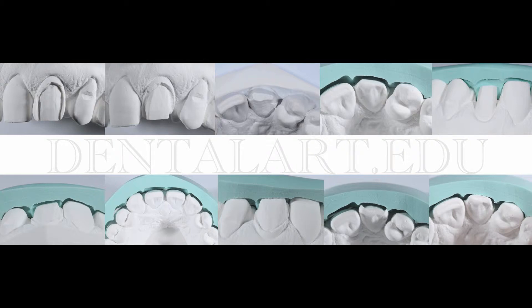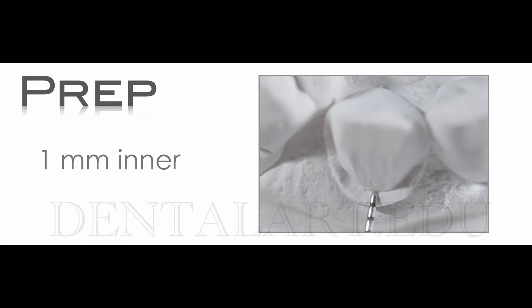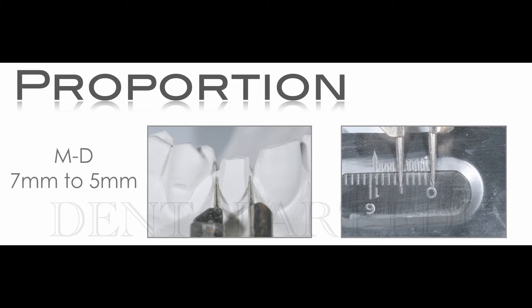We started our first prep on the model work and checked with the sectioned silicon key from the wax-up. We found we need a one-millimeter preparation, especially facially. This is very challenging physiologically because the dentist wanted to stay in enamel — he said maybe 0.7mm is possible, but one millimeter might touch dentin. I said that's okay, we can work with that, and I'll use ceramic powder to maintain translucency and manage the value of the tooth in that area.